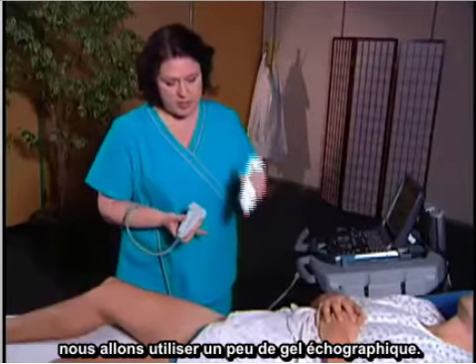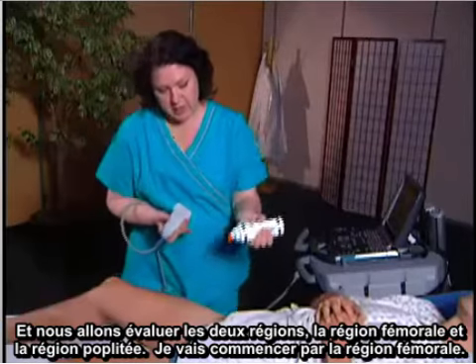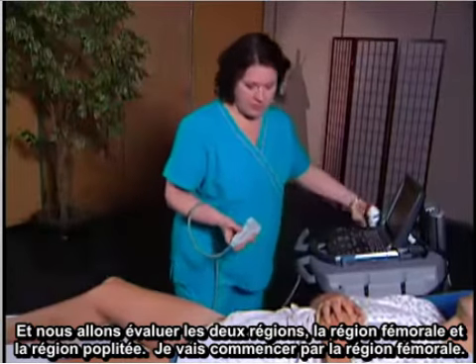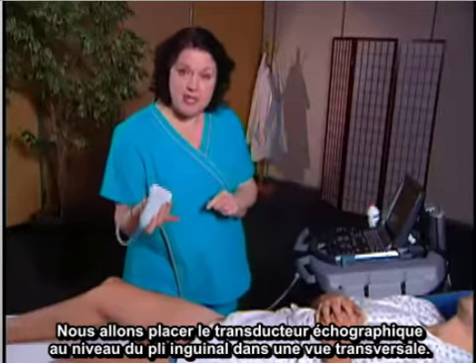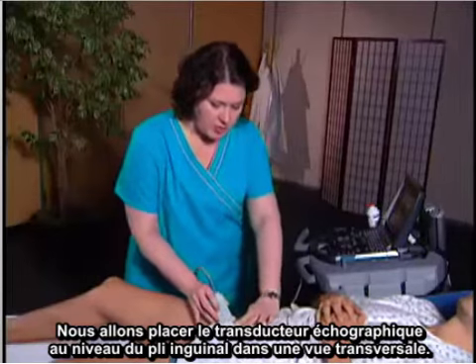We're going to use a little bit of ultrasound gel, and we're going to assess two areas, the femoral area and the popliteal area. I'm going to start with the femoral area. We're going to place the ultrasound transducer at the inguinal crease in a transverse view.